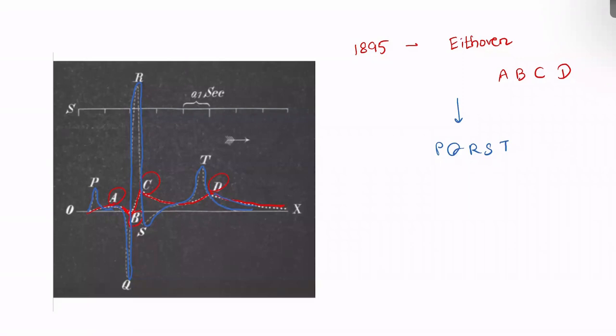Another concept is that he adopted the naming by Descartes, who named PQRST for successive points on a graph.